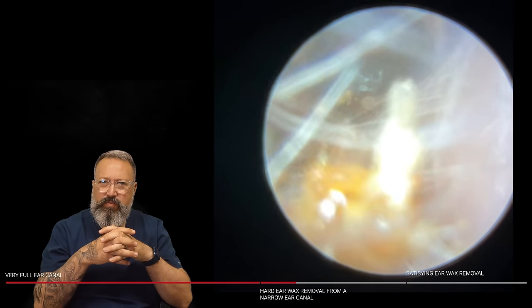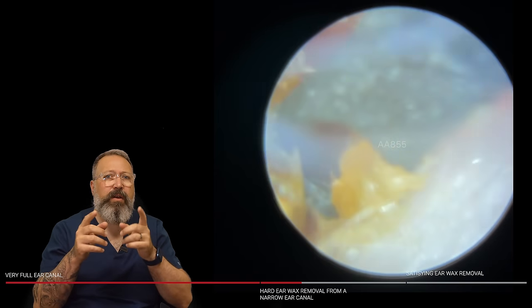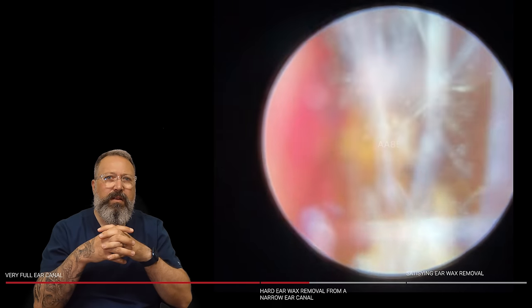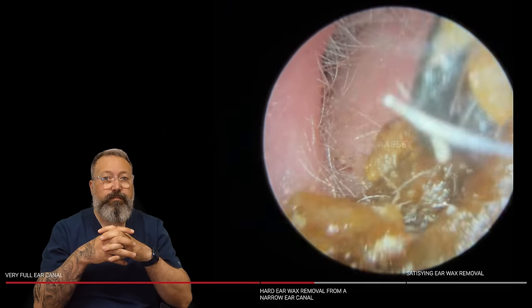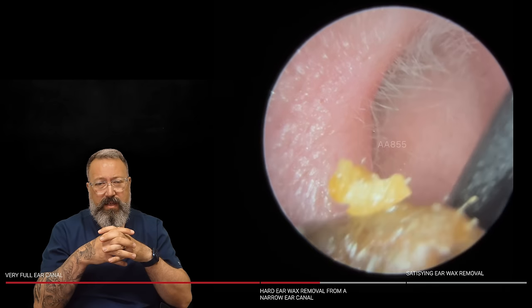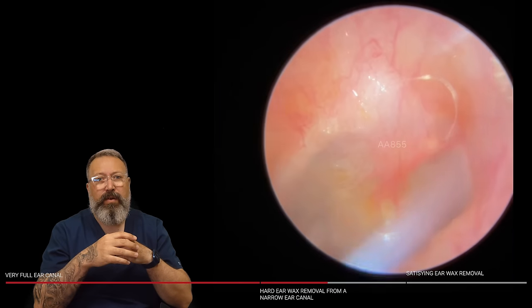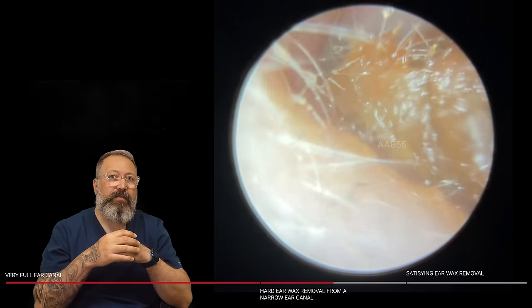Let's get the Jobson Horn in there — see if we can scoop over the top. Yeah, there's a little gap. We could have used either the Jobson Horn or St. Bart's Hook — either would have done that job. It's rolling nicely though. Is there a little bit of keratin attached? No, just a fair old-sized plug. So out that comes. It's pretty hard — I can't even get the Jobson Horn into it. We got it in the end — a good-sized plug, quite dry, with lots of little hairs embedded in there as well. The eardrum looks fab — much, much better. This is what it looks like beforehand, and this is what it looks like afterwards.